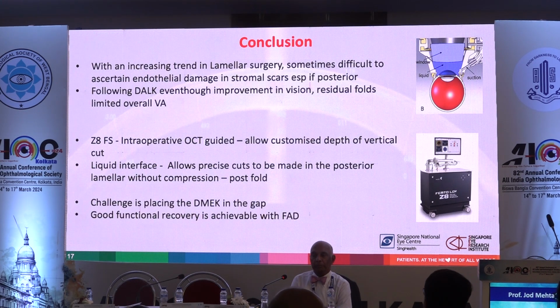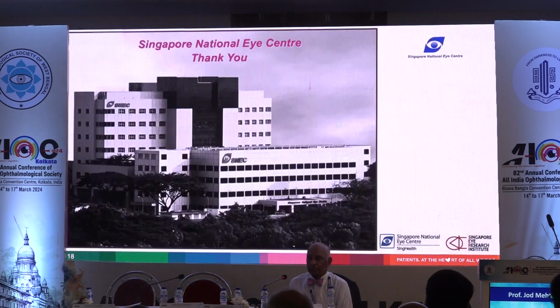The challenge is, obviously, placing the DMEK in the gap, but you can see from the results in our paper, which you'll see very soon, you can get good functional recovery achievable with this procedure.